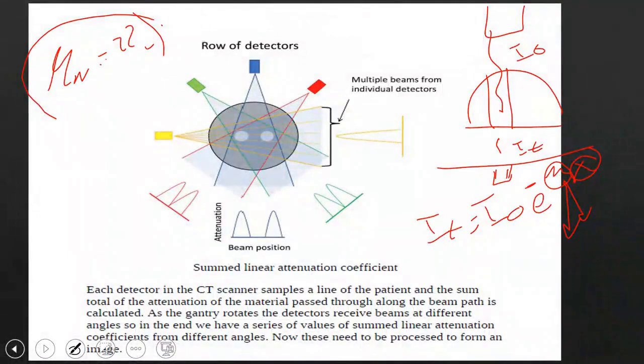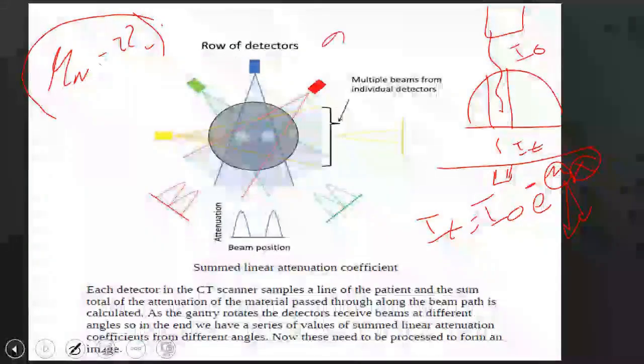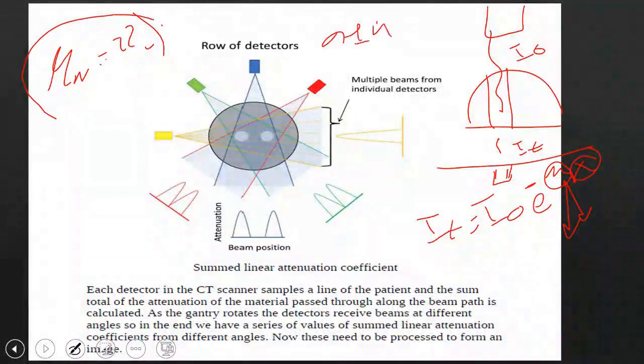They say they will use it and do water calibration, or water phantom calibration, which uses water to see the CT number for water, which is around 0 plus or minus 4.